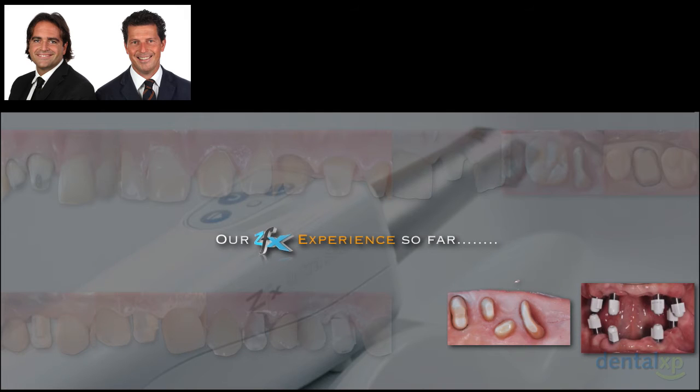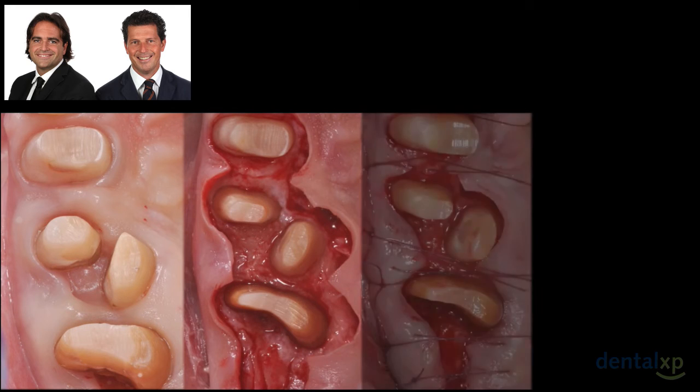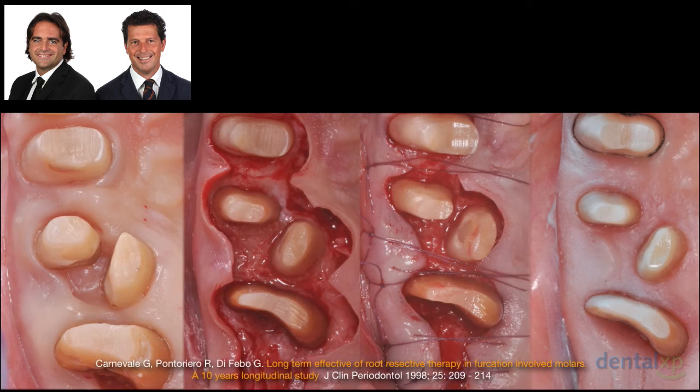So let's now move on and see how the digital solution, how the new technologies, are entering the treatment plan of more specific cases and full arch rehabilitation. Let's take, for example, this female patient that entered our office at the beginning of this year, and as you can see she was suffering from molars with furcation involvement, so periodontal disease. The treatment plan that we decided for this patient was to treat her in a periodontal way with hemisected roots, combined with an osseoresective surgery.